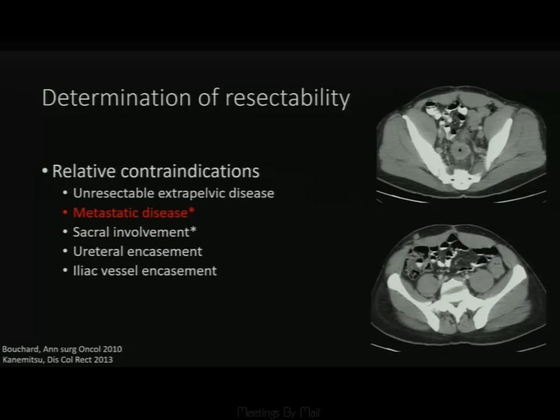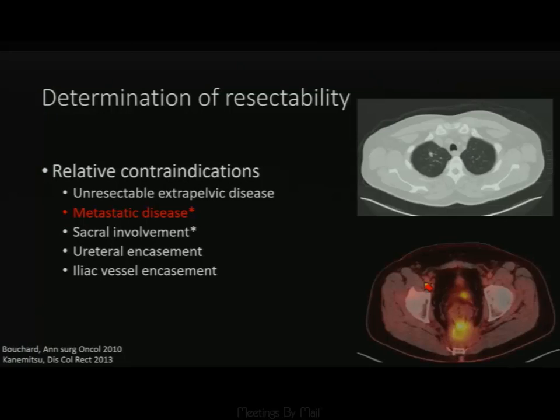When I talk about metastatic disease, surgeons will actually be pretty darn aggressive with resecting any sites of metastases, because again, for these patients, getting rid of that disease is really going to improve their survival considerably. So here was a patient, they had an implant in their abdominal wall that they thought was possibly a port site implant, as well as local recurrence, and this patient was resected. Similarly, a patient who had lung cancer met, they're very inclined to resect local lung metastases.